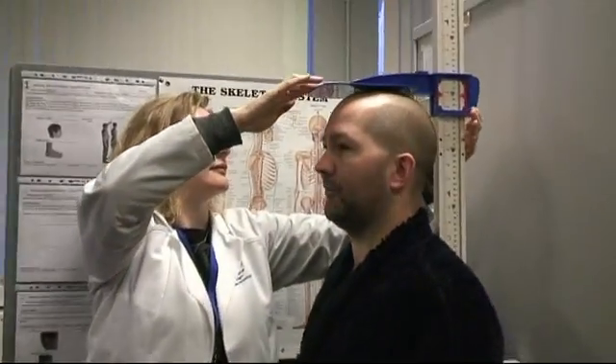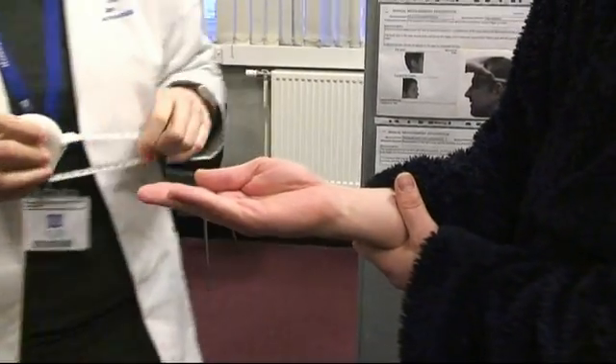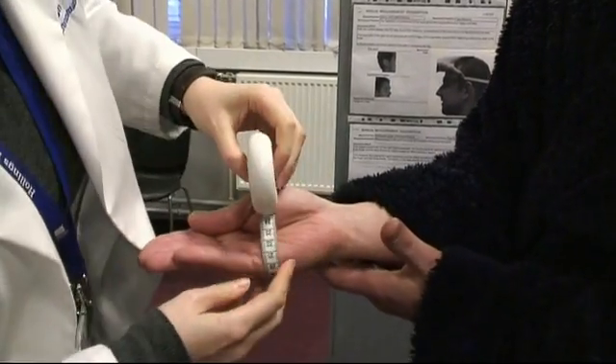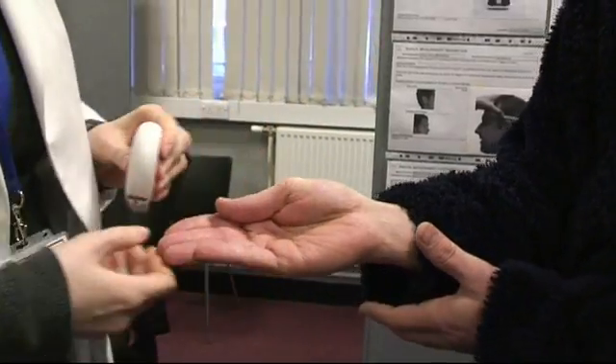The next step is to step onto the anthropometer, move your heels to the back of the board looking straight ahead, and the technician will move the plate down to the top of the head and record your height. The next manual measurement is a hand circumference — the technician will take a circumference around your hand, gauging the largest circumference when it's in the position of the smallest possible circumference it can make.